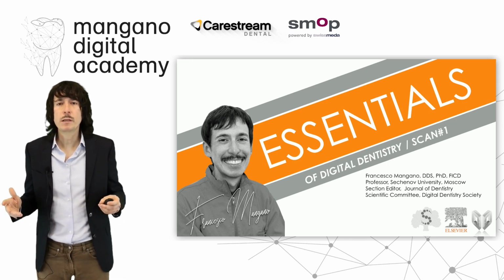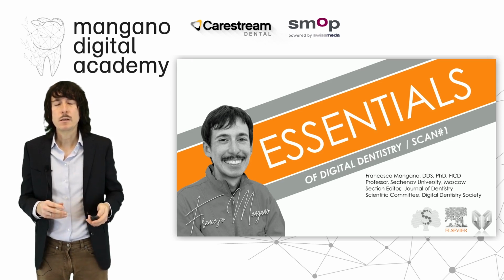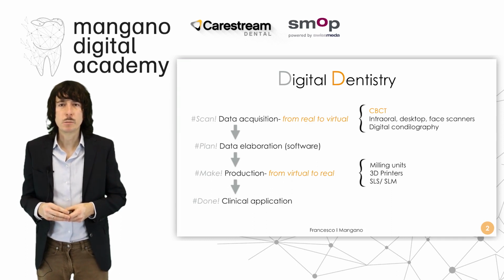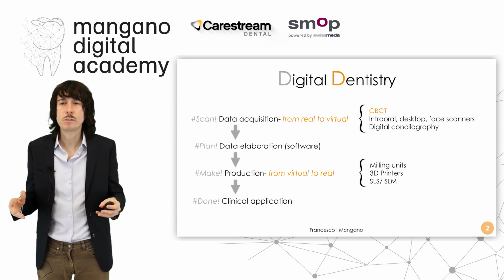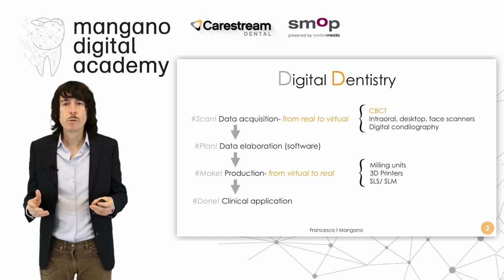The first topic we will talk about is the workflow in digital dentistry, because it's very important to define the different phases of the work. So our workflow is based essentially on 4 phases.